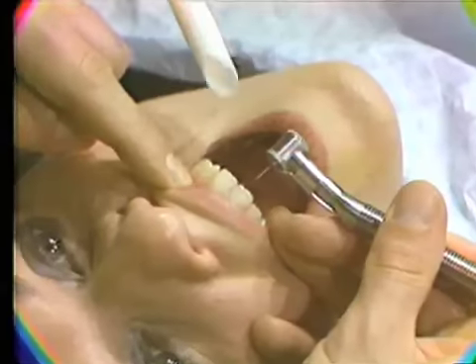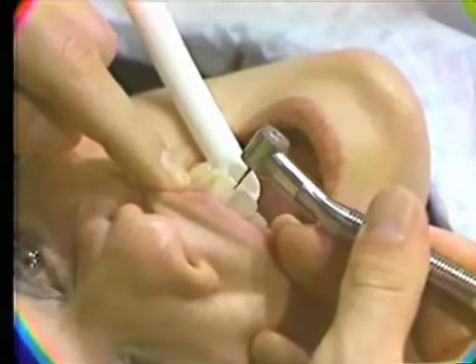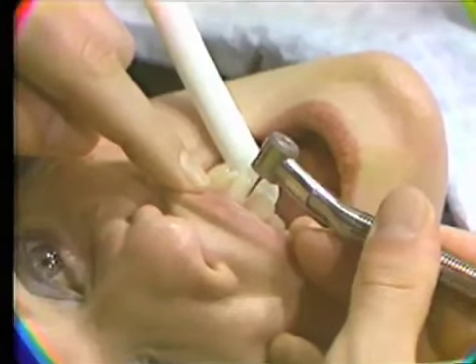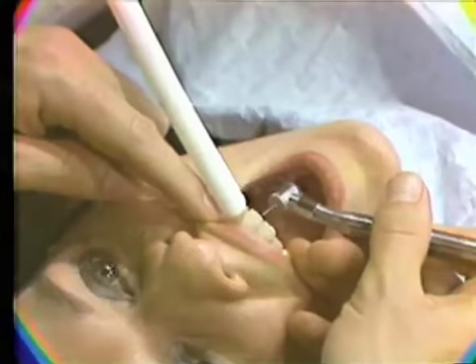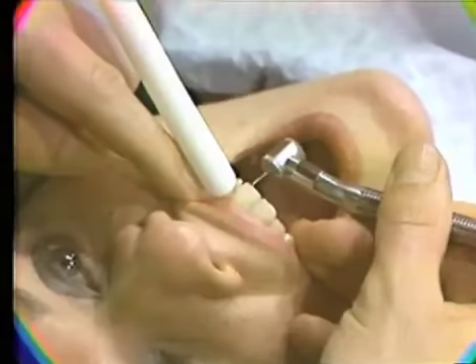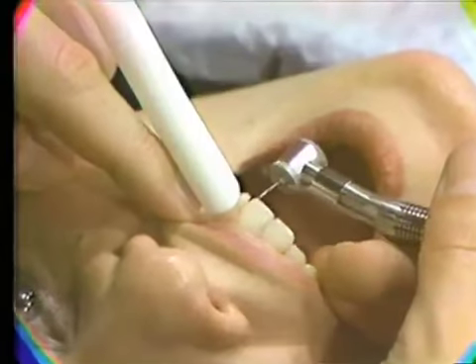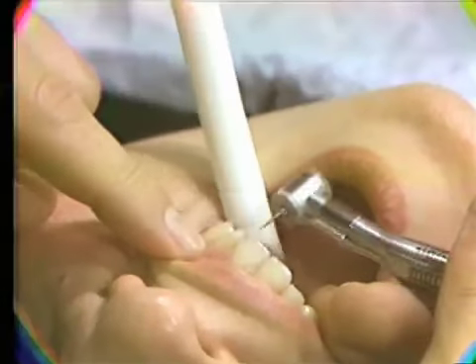The evacuator tip is placed near the tooth being prepared with the opening toward the handpiece. It is generally located on the lingual aspect. However, it is often repositioned on the labial aspect if the water spray tends to escape over the patient's upper lip. The chairside assistant should monitor fluid accumulation in the patient's mouth and remove it whenever the operator pauses during the preparation.